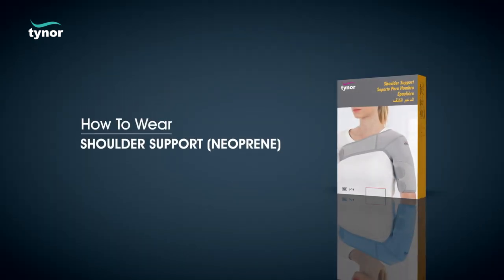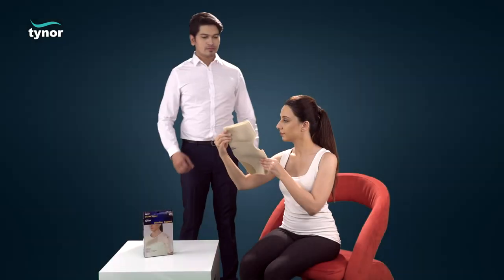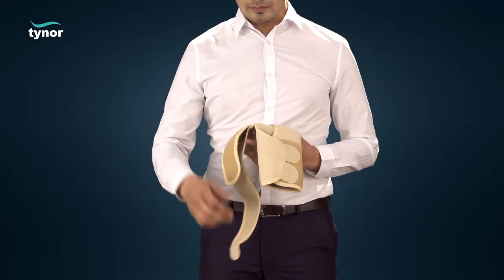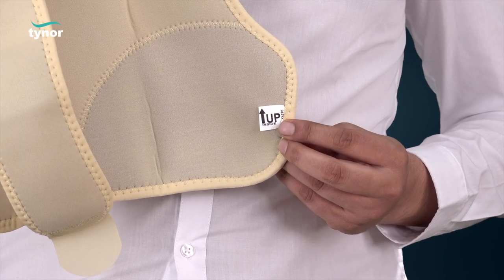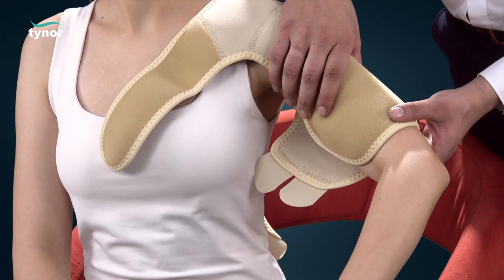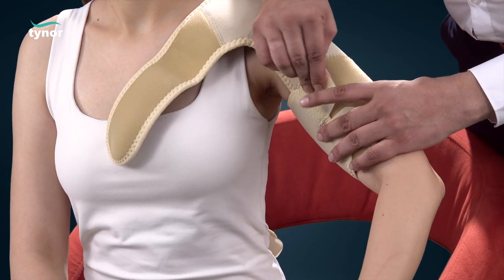Now let us see how to wear the shoulder support neoprene. See the up inside label to position the product correctly. Pull the sleeve up over the arm and shoulder. Close the sleeve hook and loop closures to a comfortable fit.